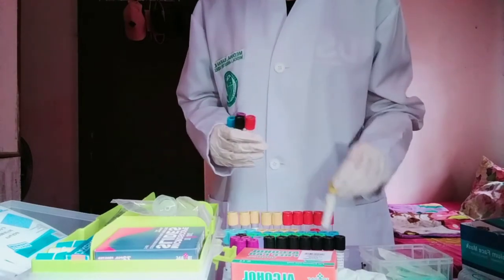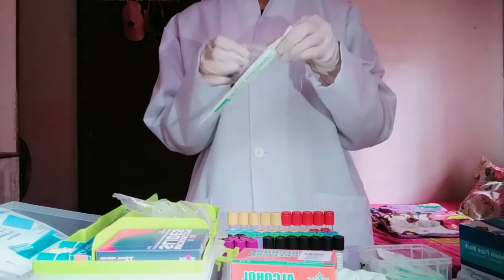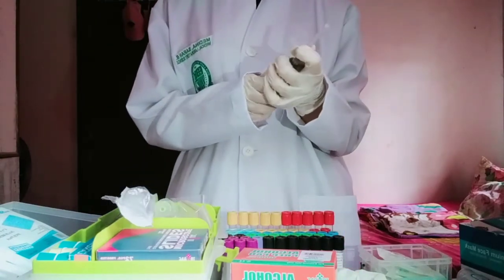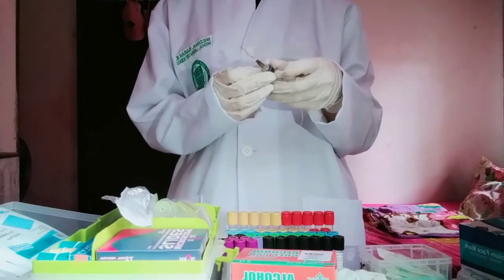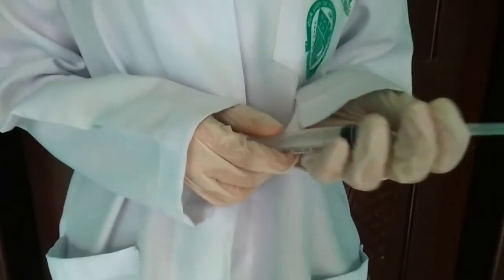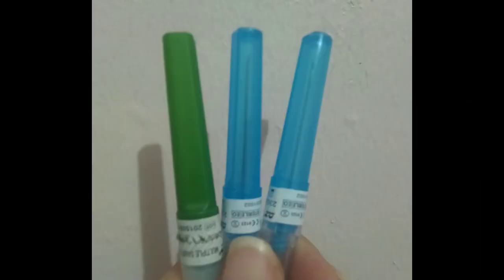Sterile disposable needles are used for drawing blood and are designed for single use only. Different gauge sizes are appropriate for different veins, different patients, and different uses. The higher the gauge, the smaller the diameter of the needle.